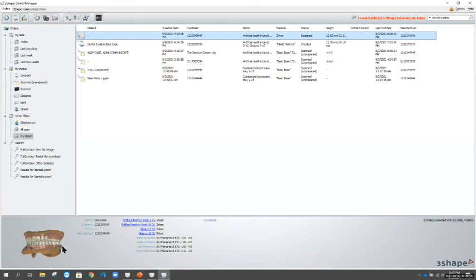Great. Thank you. I'm hearing more and more technicians leaving out the post-dam, especially on milled dentures, because they fit so well. Yeah. I've had some customers tell me that they've had issues with putting the post-dams in because the patients cannot get the dentures out. Amazing. Yeah, that's amazing, actually.